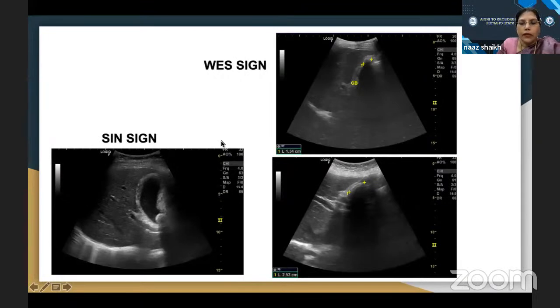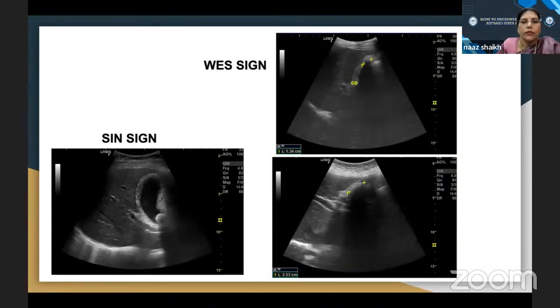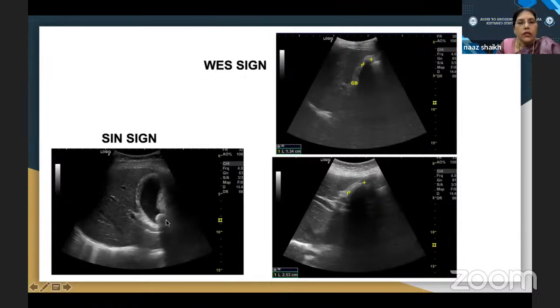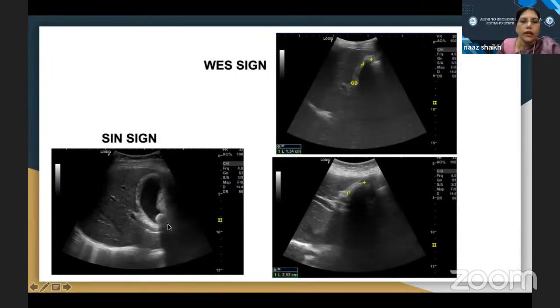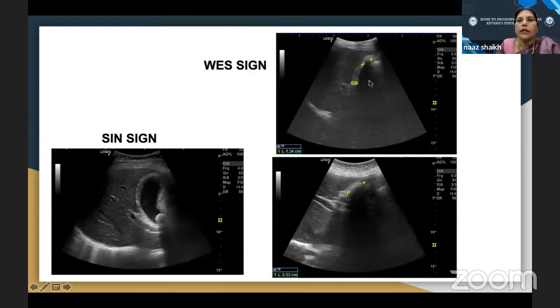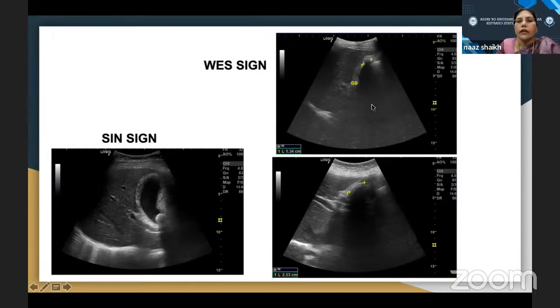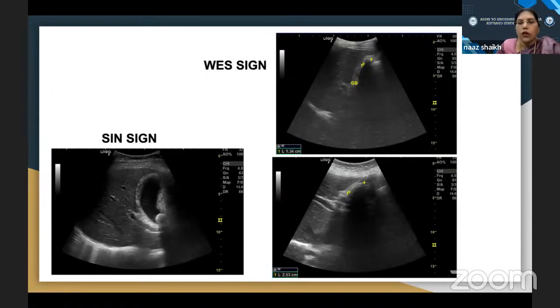This was cholelithiasis with multiple stones in the CBD and cholangiolithic abscess. Very important for all surgeons are ultrasound signs for the gallbladder. The SIN sign — stone in the neck sign — when you see this, never delay; no conservative treatment at all. Operate as early as possible because of distension; the patient may go into gangrene of the gallbladder leading to generalized peritonitis, and may develop Mirizzi syndrome with a long time delay. Another important sign is the WES sign — wall-echo-shadow sign — a gallbladder studded with calculi that appears as just a hypoechoic shadow and is mistaken for a normal gallbladder with no calculi.